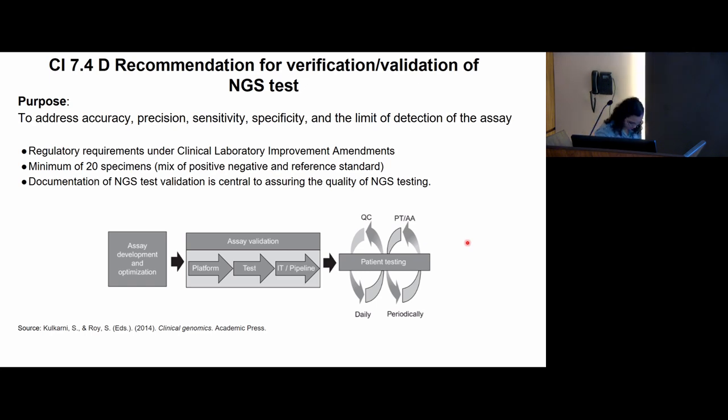So for example, let's say a TET2 mutation in AML. We know that it should go maybe tier 2 because it doesn't have a clear-cut diagnostic or prognostic significance. But there may be specific subsets of AML where it is more important. So if you're looking at that subset, should you upgrade it to tier 1? So this kind of question you always have.